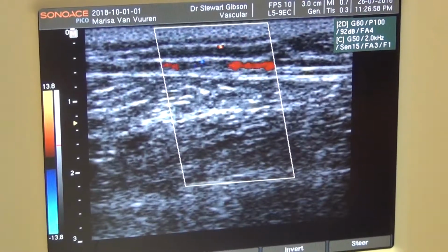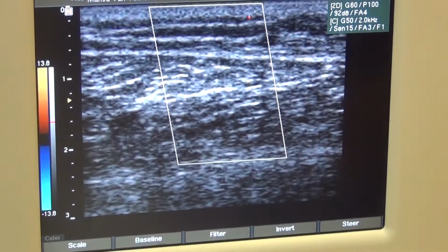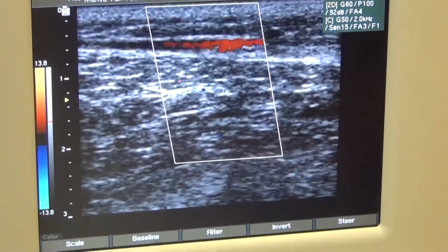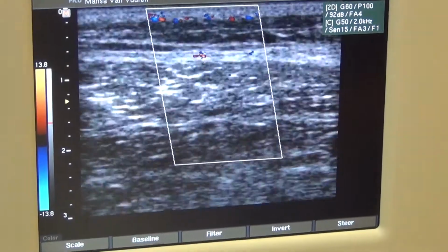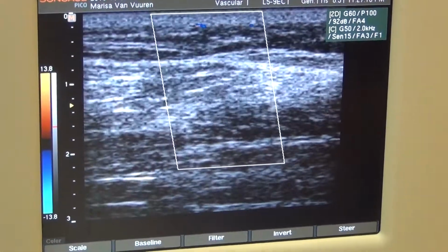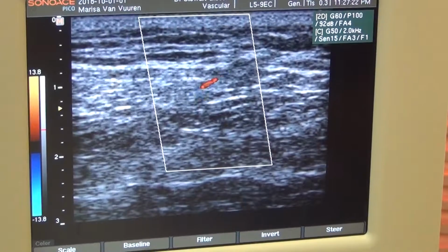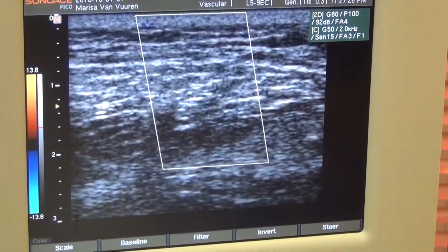There's little doubt that there is an arterial connection with the great saphenous vein due to the fact that we have arterial blood in the great saphenous vein and we have a pulsating venous return in the great saphenous vein, as well as the appearance of an arteriole in the area adjacent to the area of maximal pulsation in the great saphenous vein.